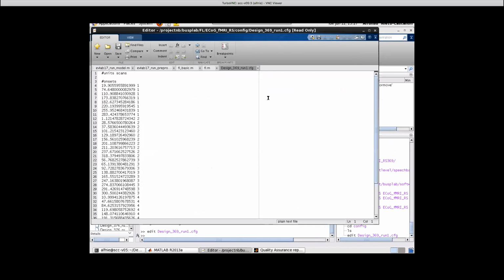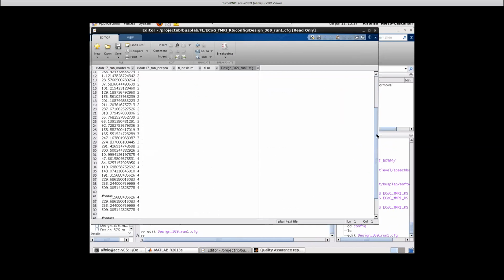The other thing. Oh, Alfonso. Still there? Yeah, go ahead. So with continuous acquisition experiments, like all the repetition suppression experiments, basically, at one point you had mentioned that if we're doing the slice timing correction, then we should adjust all of the onsets of the individual trials.